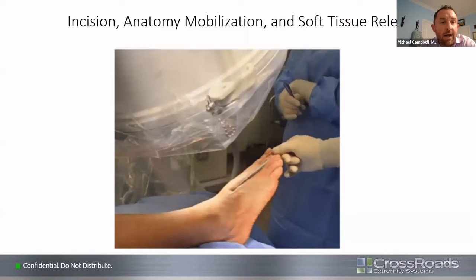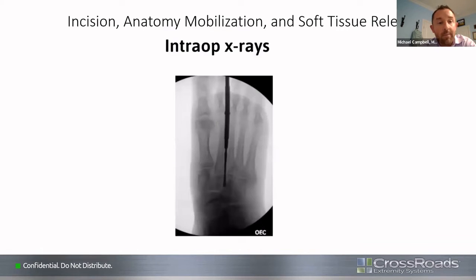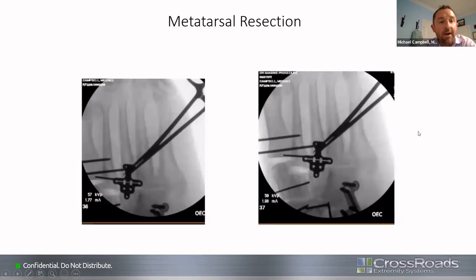So going through this case, like I said earlier, whenever I start one of these cases, I really think for midfoot, if you want to be happy, getting your incision in the right position is critical, or you end up having to make a huge cut, or you end up stretching the skin and ending up with a wound complication. So I always start by checking my spot, and you can see over here this gapping in his displaced Lisfranc injury.